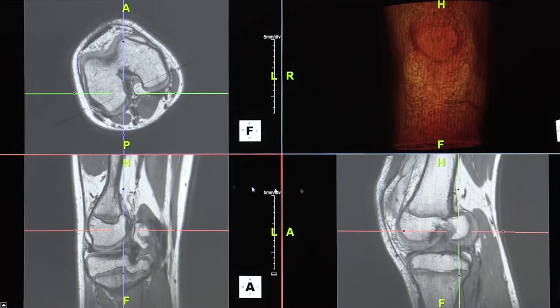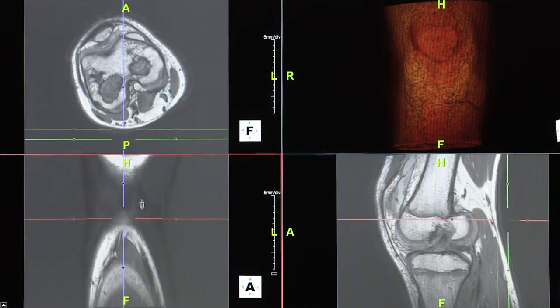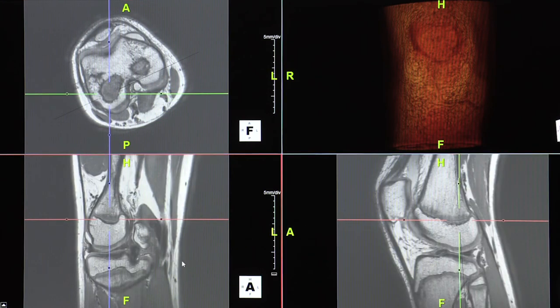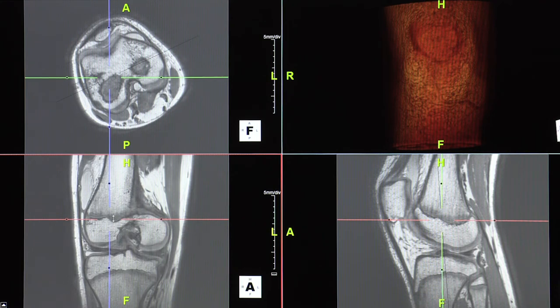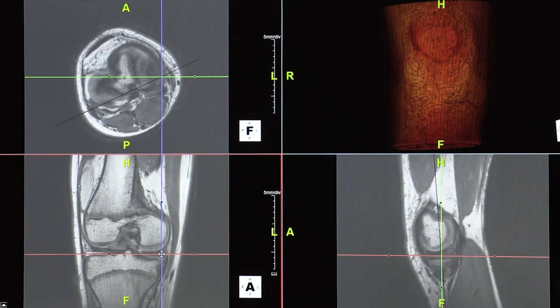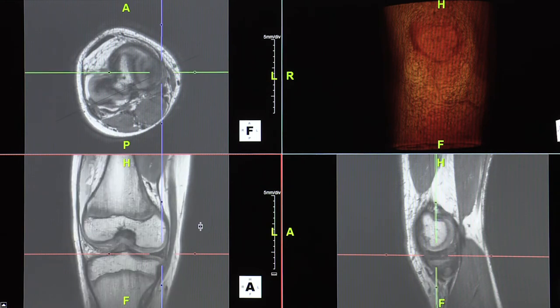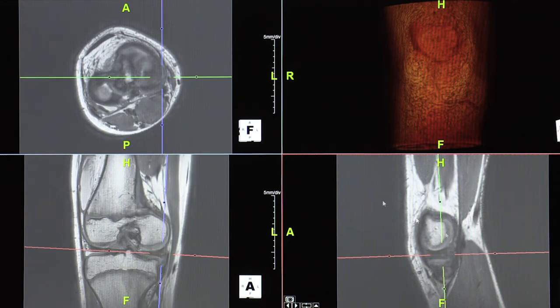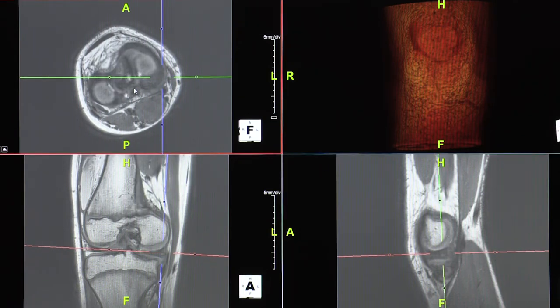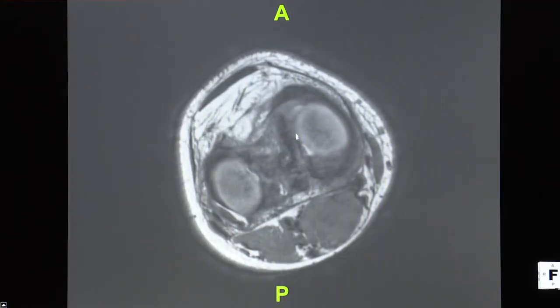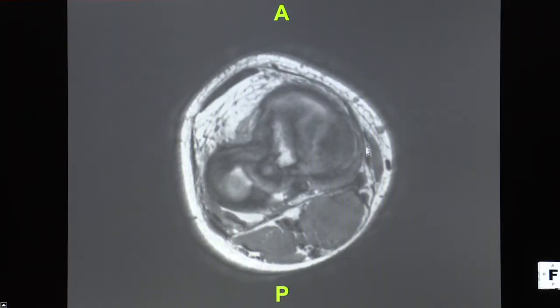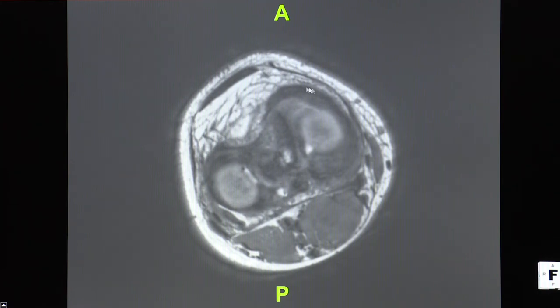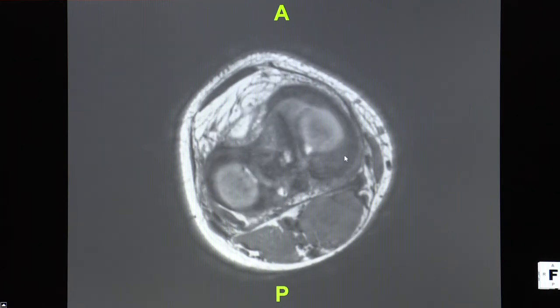I've loaded a knee — a young knee, one of the examples from the presentation — and you can see it's fairly isotropic in all three planes. First we want to see the medial meniscus, so I bring it on the medial meniscus — the thicker side. I angle along that. This was acquired as non-fat-sat, so it's harder to appreciate tears; that's why we do most of them fat-sat. But here you can see the medial meniscus all the way through.